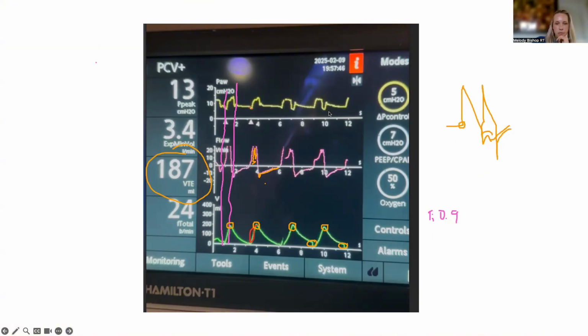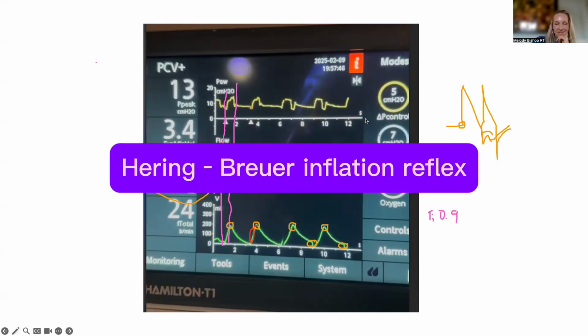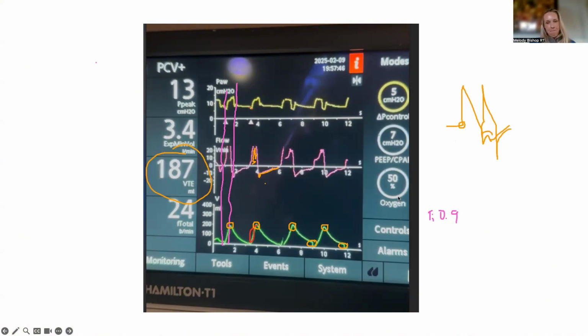Then what happens is the diaphragm gets loaded and it invokes this reflex called the Hering-Breuer reflex. I can't say it, but you can look it up. Then the diaphragm contracts, which is what you're seeing here. It's a violent, forceful contraction because it's pulling pressure out of the circuit. Then you have a pressure differential, so then you have flow, then you have a volume. That could be leading to auto-PEEP, which is then leading to low tidal volumes.